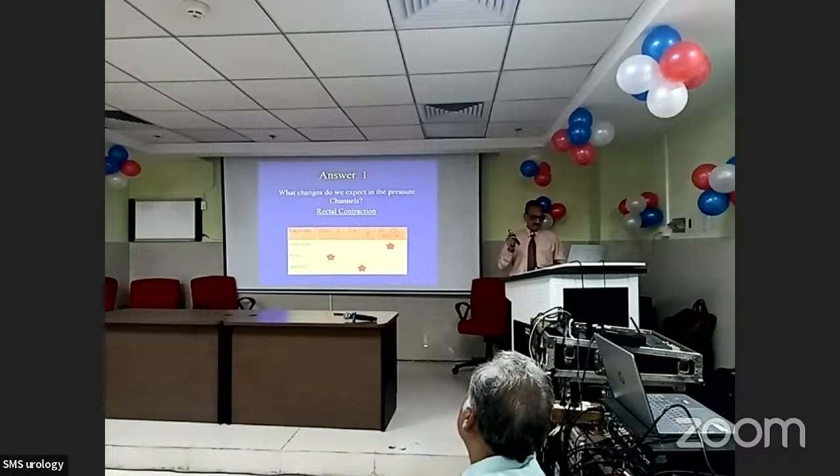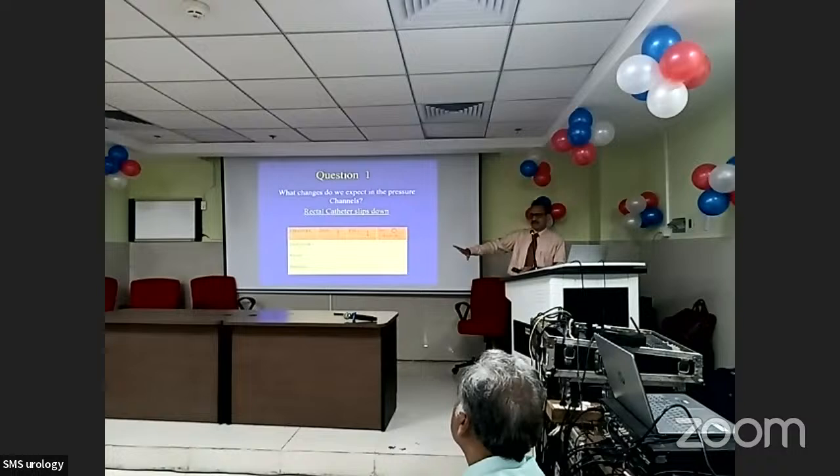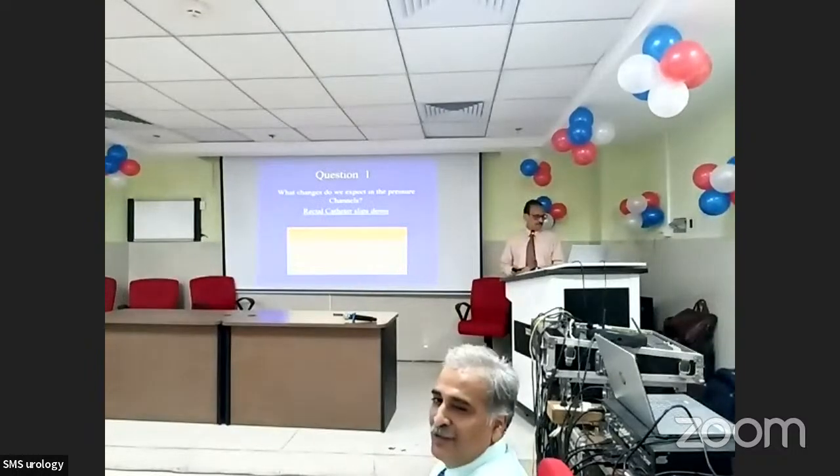Okay? Consider one more situation. What change do you expect? Say the rectal catheter slips down, out of the rectum, onto the floor, while you have the intravesical catheter in place. What will happen to intravesical pressure? What will happen to rectal pressure?